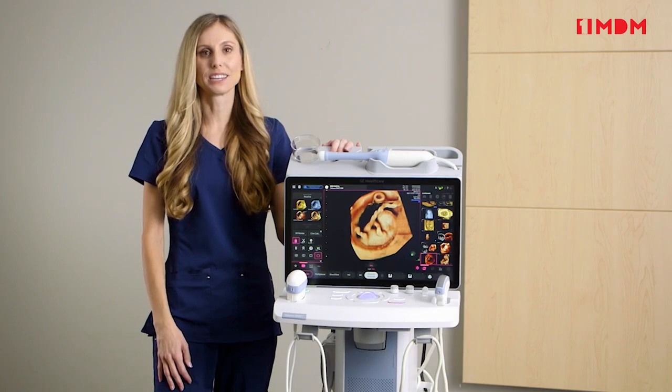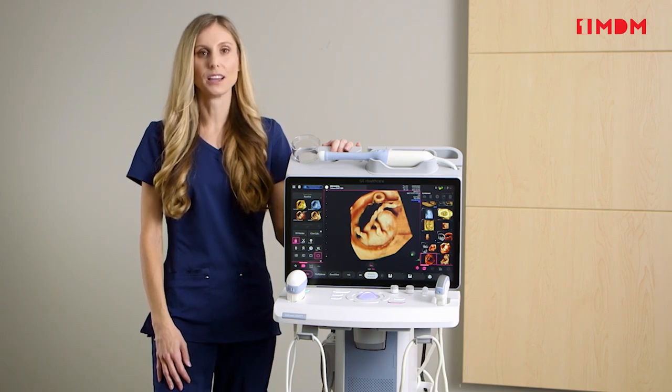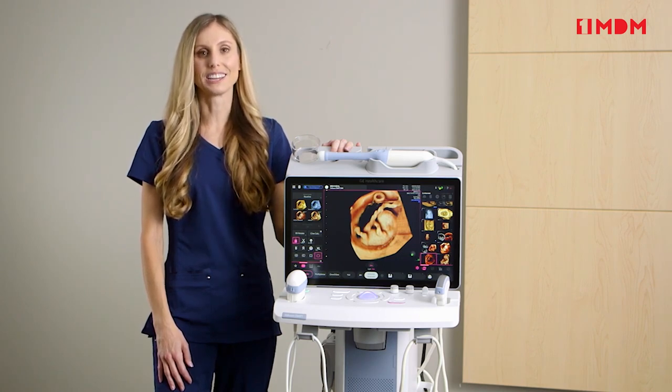Hello, I'm Connie Boats, application specialist for GE Women's Health Ultrasound with our latest introduction to the Voluson portfolio, the Voluson Swift. Designed based on customer feedback, the Voluson Swift is the most streamlined Voluson in our portfolio.